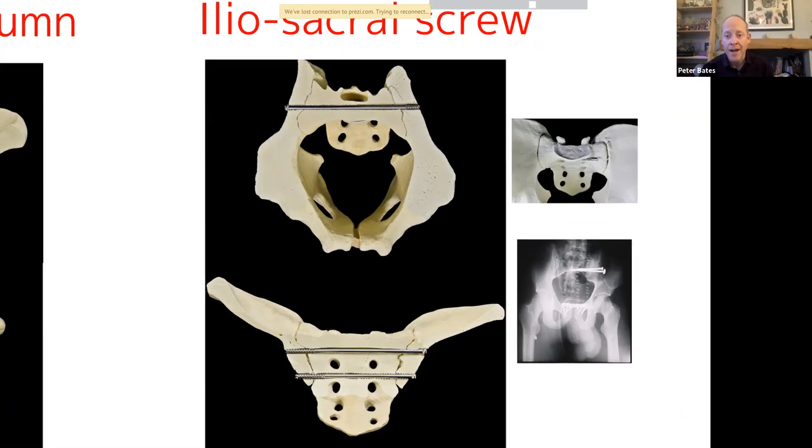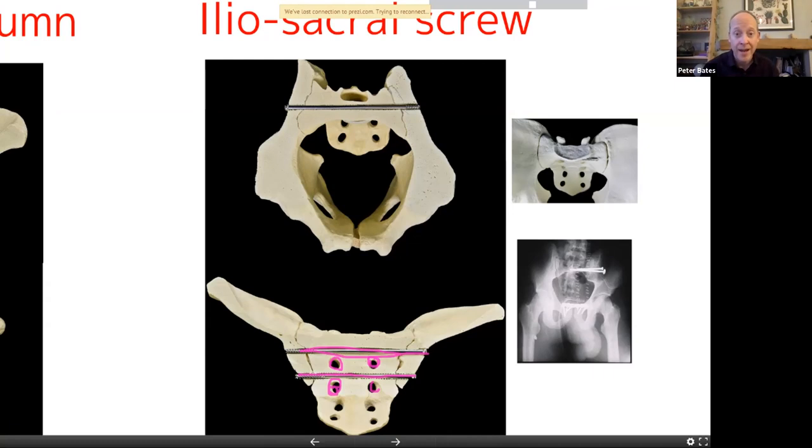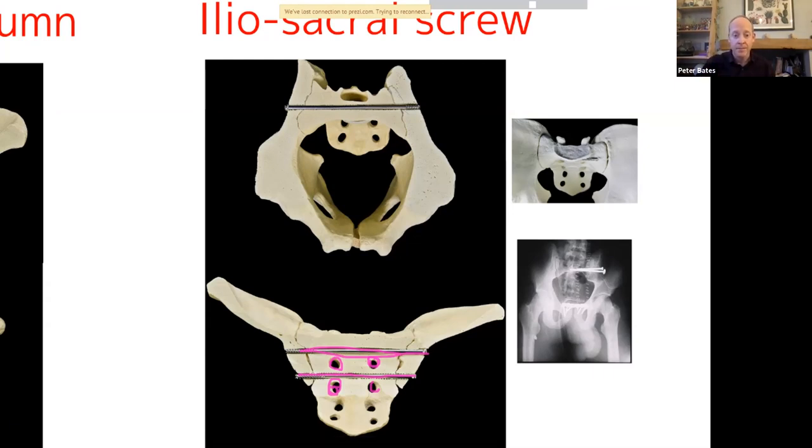You've got these things called iliosacral screws, which go across. So this here in the sacrum is the S1 foramen. That's S1, and then below that, you've got S2. So the idea is to shoot your screw. This one goes above the S1. This one goes between S1 and S2. And that's what it looks like on outlet view, and the one above it is what it looks like on an inlet view. The inlet-outlet view is the ones we use in theater.